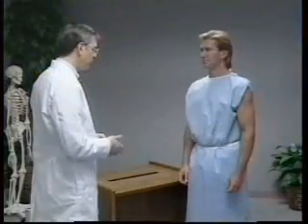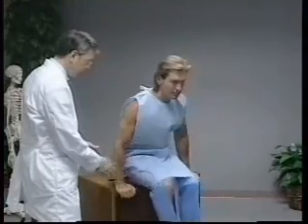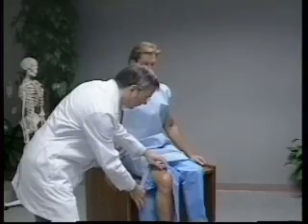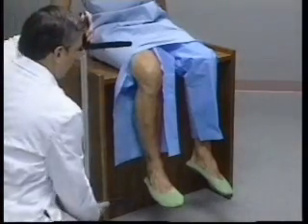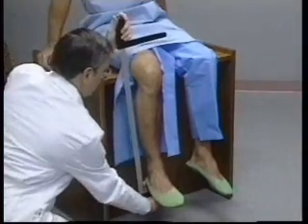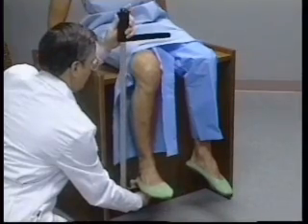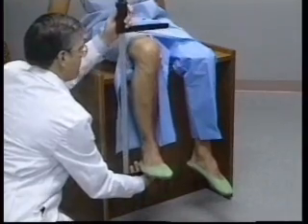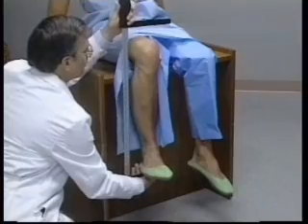Knee height is measured only on adults aged 60 years or older. The person sits upright on the measuring table with both legs hanging freely over the edge of the table. The technician places the fixed blade of the large sliding caliper under the heel of the right foot just below the lateral malleolus of the fibula. The right foot is held in the palm of the technician's right hand. The technician raises the subject's leg slightly so the knee and the ankle are both positioned at a 90 degree angle.